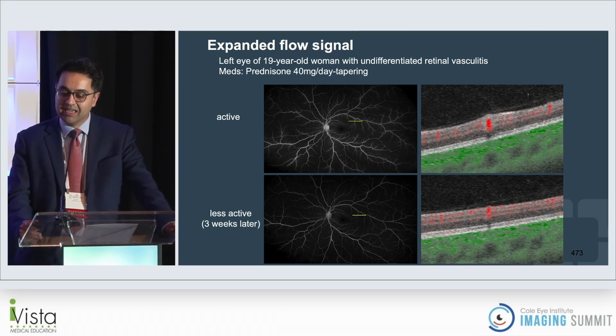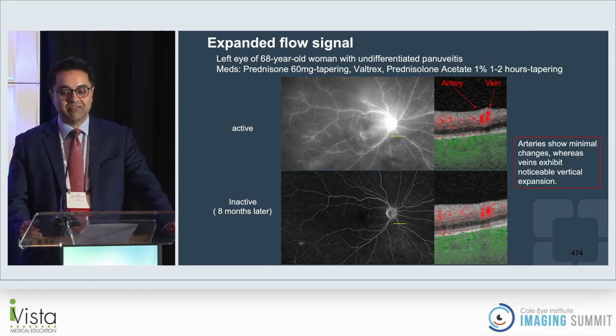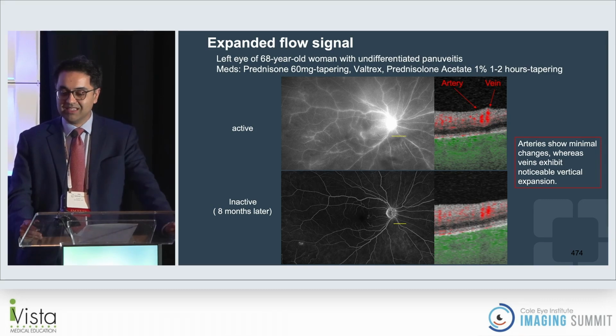And so maybe if we really dive into this and figure out a way to look at this in a quantitative manner, we'd be able to look at that and actually say when someone is active or inactive just based on OCT and OCTA alone.